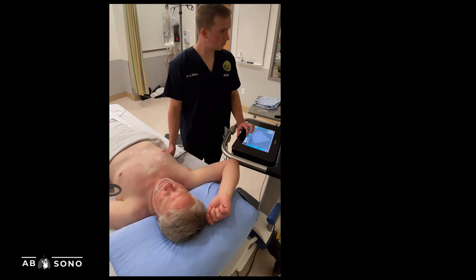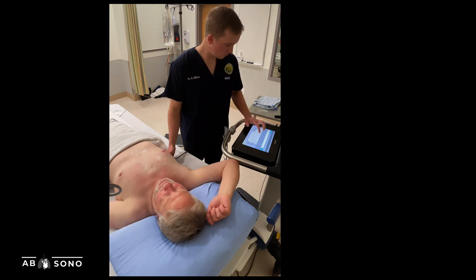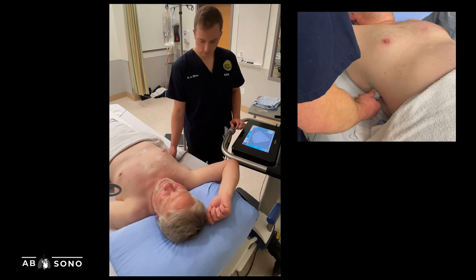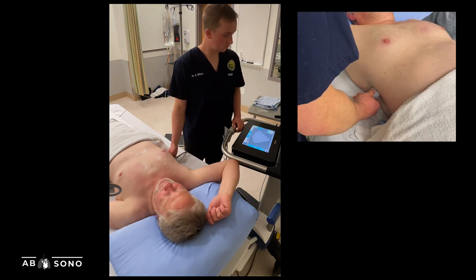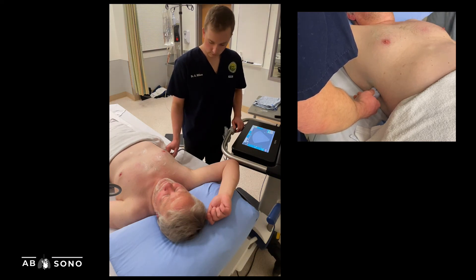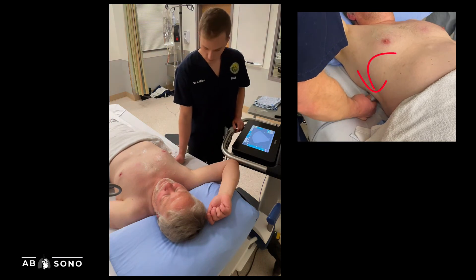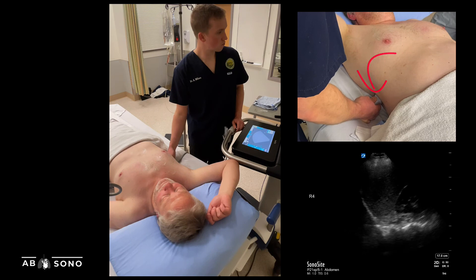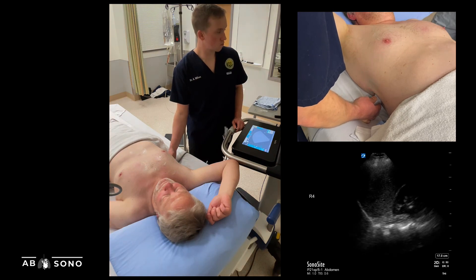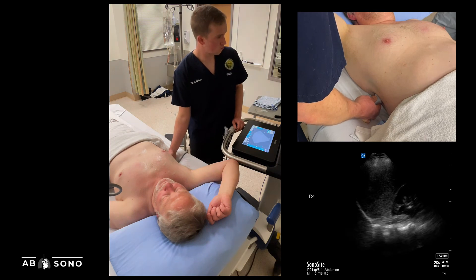Zone four, also called the PLAPS point, can be the most challenging to image in supine ICU patients. The aim is to image the costophrenic angle at the most dependent point, as this is where pleural effusions and other lung pathology tend to collect. Starting at zone three, slide the probe posteriorly while fanning anteriorly until you are over the posterior lateral chest wall. You will often need to push your hand into the bed or turn the patient in order to optimize this view.